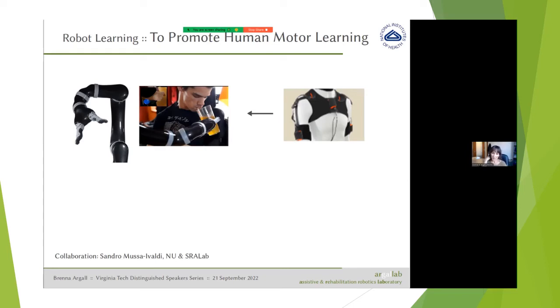And they've shown that people can use this interface even when they have high-level cervical spinal cord injury. So if your injury is incomplete, you might have a little bit of residual motion left in the shoulders, and that little bit of residual motion is enough to be able to operate this interface. An advantage to using this kind of interface over, for example, a brain-machine interface is that you have to move to operate it. And so they've actually shown in a clinical trial that you can increase lateral forces in the shoulders, so it potentially can promote rehabilitation recovery.